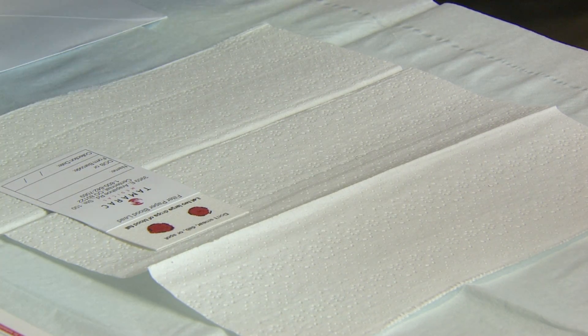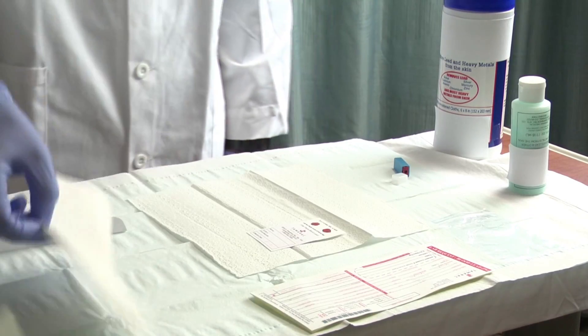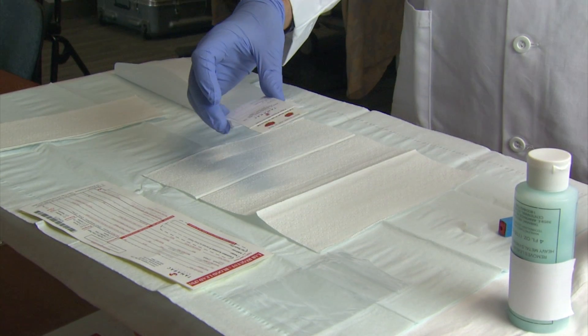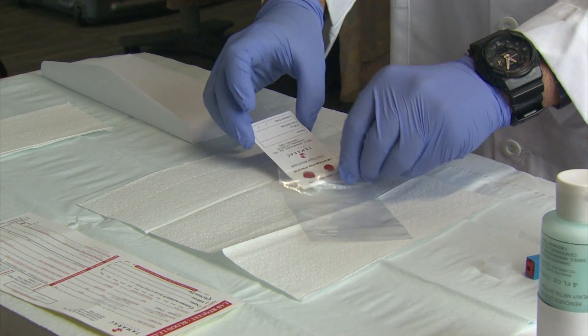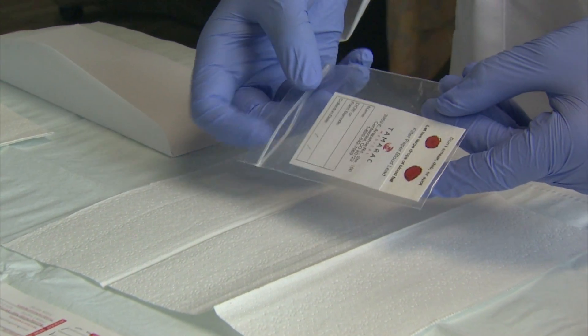Gently cover the filter paper card with a paper towel like a tent and allow the blood spots to dry. A color change from bright red to reddish brown indicates that the blood spot is dry. While holding the patient's name area on the card, reinsert the dry card into the plastic bag with the blood spot side first, then seal the bag.